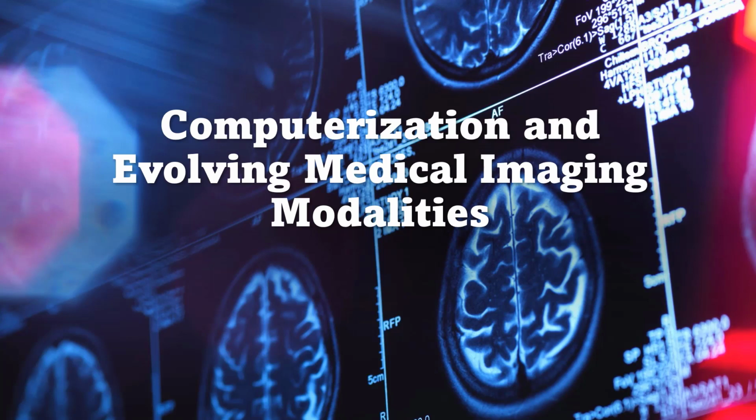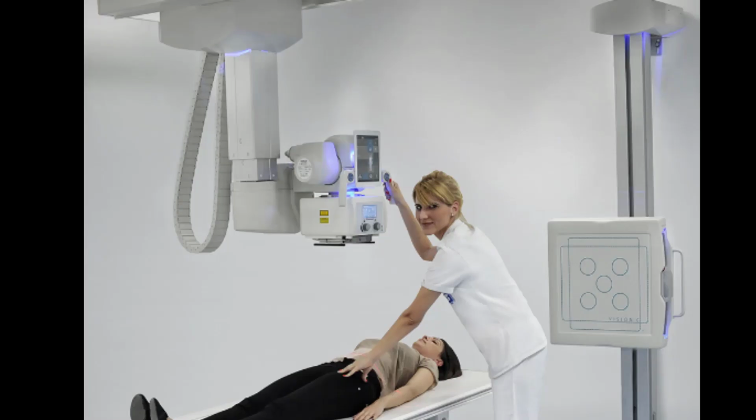When analyzing a film screen image, you see what has occurred, and what you have is all that you're going to get. Whereas when you're looking at or analyzing problems in digital imaging, you have 3 different areas to start analyzing. The first area is the acquisition of the digital information, which can be the equipment, the patient, and the techniques used.